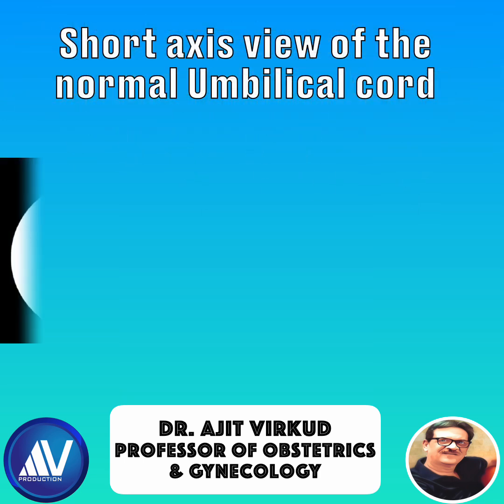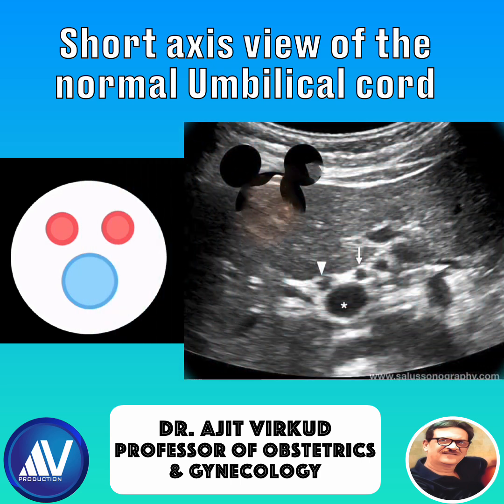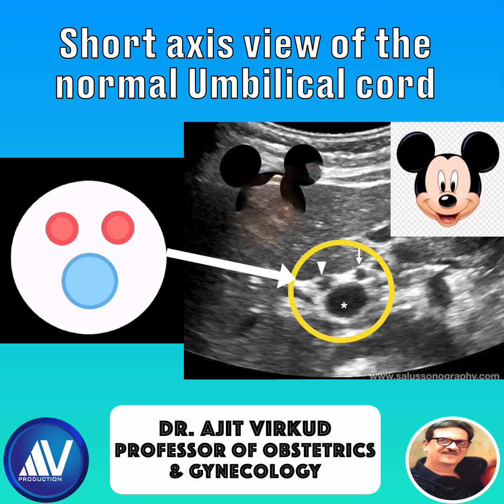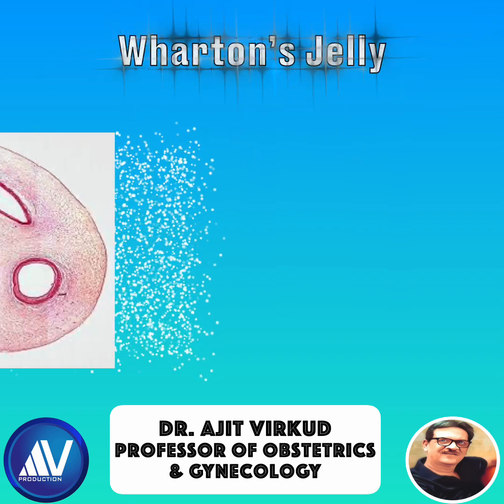On short axis view, the two arteries are seen lying oblique to the vein, giving the characteristic and diagnostic Mickey Mouse sign. The two arteries represent Mickey's ears and the vein represents Mickey's face. The diameter of the umbilical vein is twice that of the umbilical arteries.